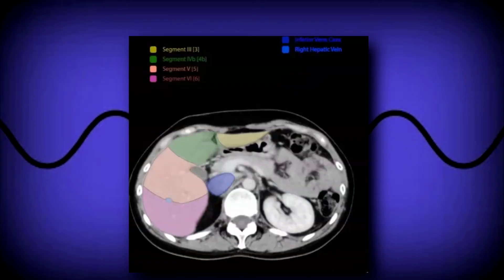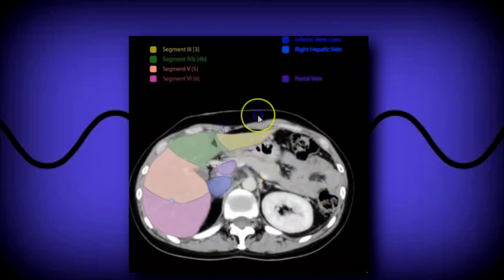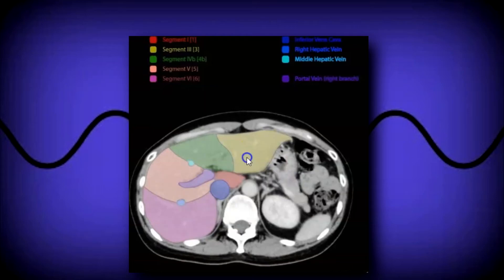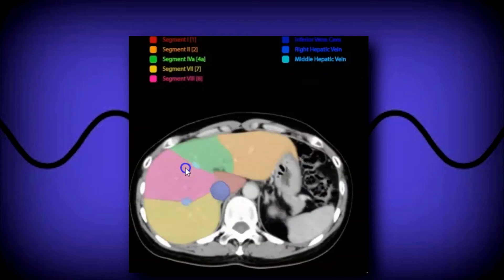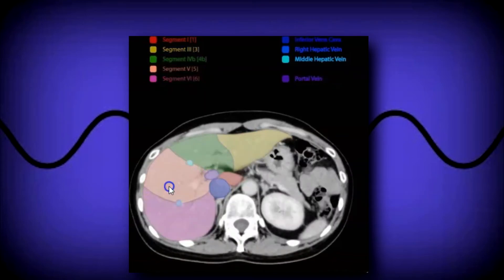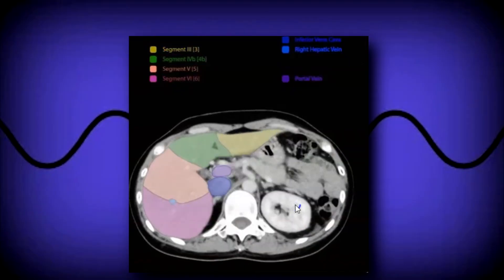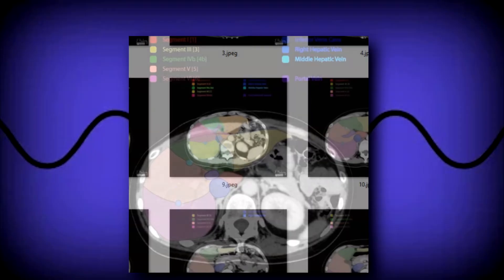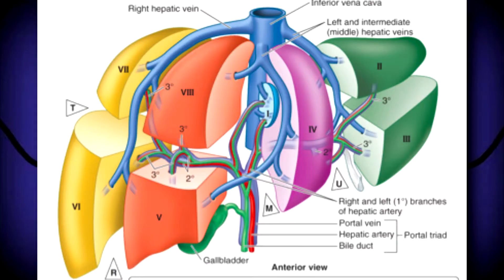The falciform ligament separates segments 2 and 3 from segment 4. The middle hepatic vein separates these two segments: superiorly it's segments 4a and 8, inferiorly it's segments 4b and 5. So again: lateral left, medial left, right anterior, right posterior. Now let's look at some ultrasound views, beginning with sagittal.